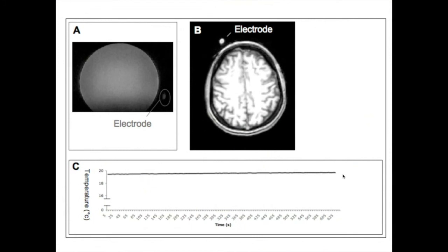We also use conductive gel, not saline, in the scanner because it doesn't dry out, and it allows us to be surer that we're getting consistent current across the whole of the electrode and not getting hot spots, because that also would be where we would worry about heating. So conductive gel, Ten20 paste or something, allows you to make sure that the electrodes continue to work. You don't get drying out, and you don't get patchy connections between the electrodes and the scalp.